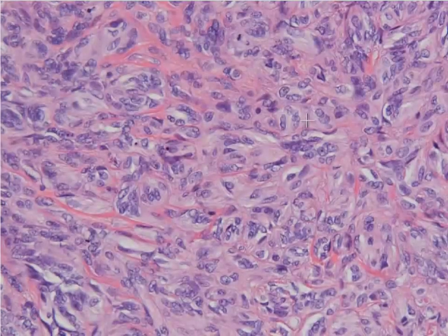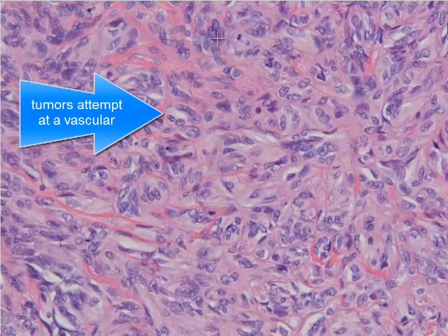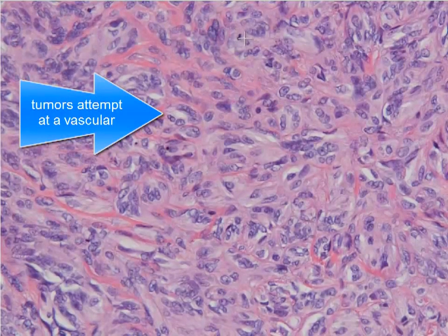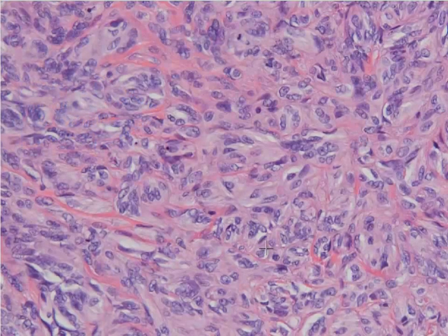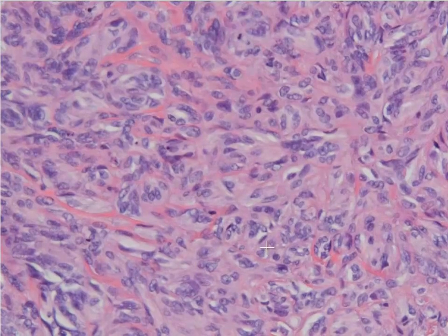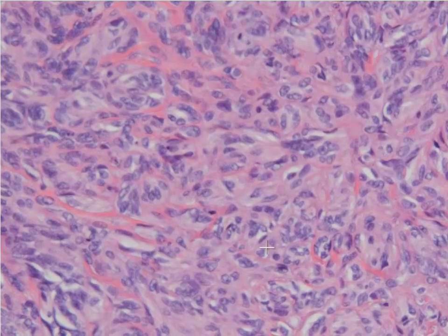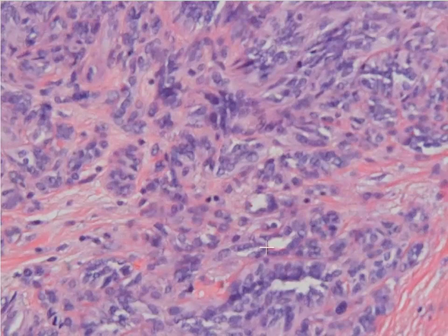At higher power you can see that there's a lot of nuclear overlap, a lot of nuclear atypia, and mitotic figures scattered throughout this tumor. There are a lot of atypical stromal cells — which are basically endothelial cells — and a lot of mitotic activity.